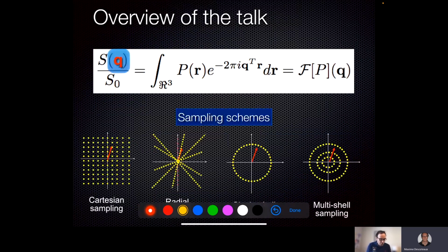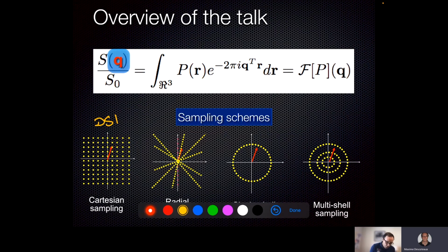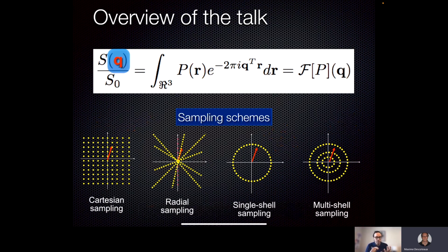And so there are lots of options to measure the signal Q, and we'll see a few of those options today. Either you can measure Q on a grid, this is often called DSI, or Q-space imaging. There are radial sampling schemes that are less popular, but otherwise, when we talk about single shell versus multi-shell, which in a sense means single b-value versus multi-b-value, anything within this sampling scheme will have an impact on the spherical function, on the propagator, on the ODF you can extract.